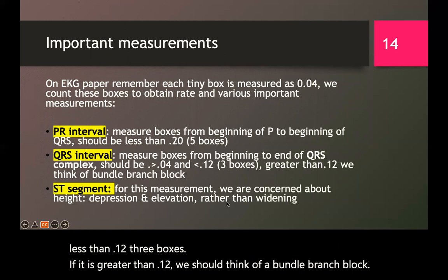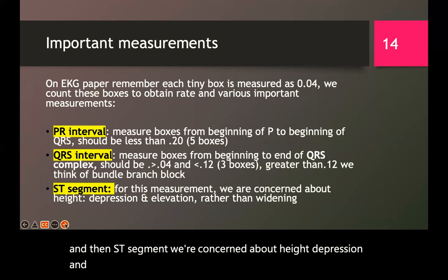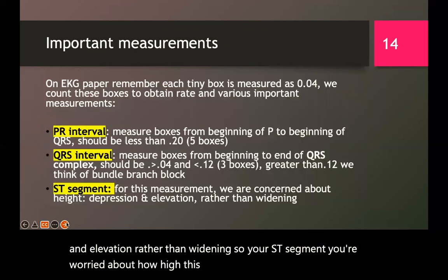And then ST segment, we're concerned about height, depression and elevation rather than widening. So your ST segment, you're worried about how high this goes, okay? Or if it becomes depressed.